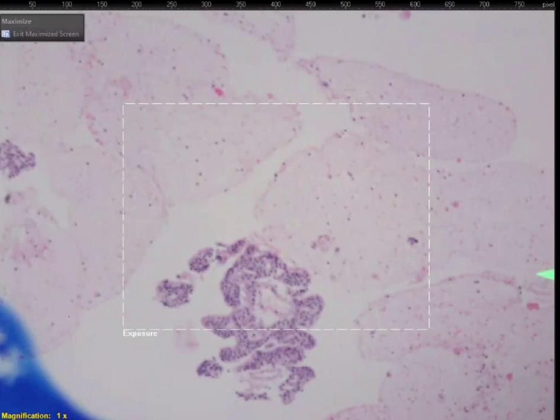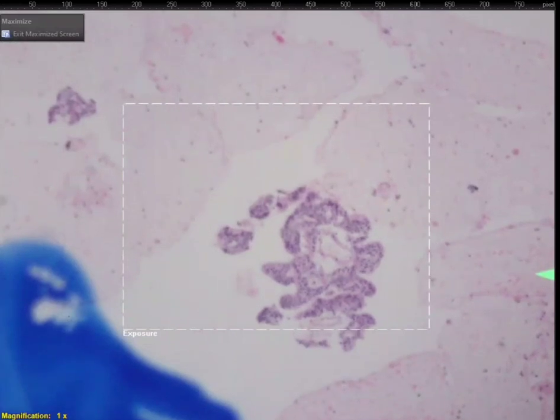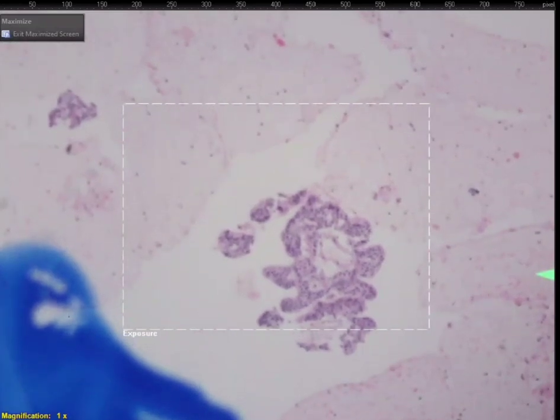And it was a 78-year-old male. Okay, there we go. The lymph node was very far, that's why our differential was wide. We were being safe, right? We did go renal cell actually, which was also far. But no problem. Okay, very good. So we got some very good conversation there on that one.